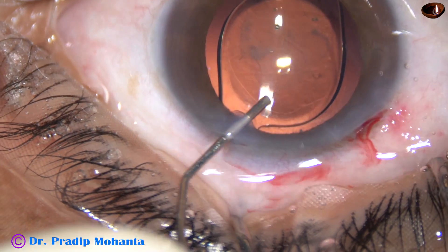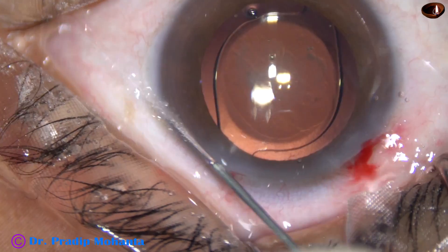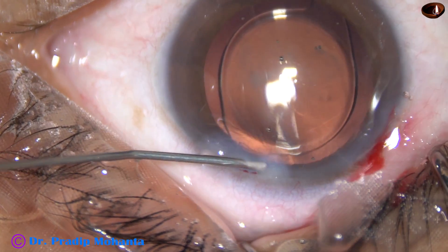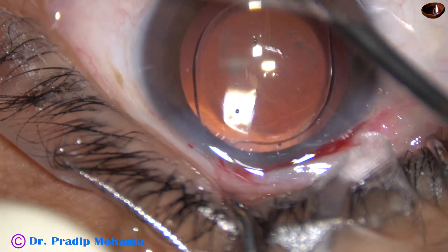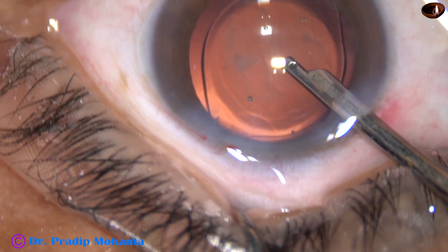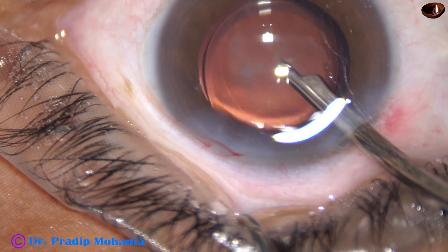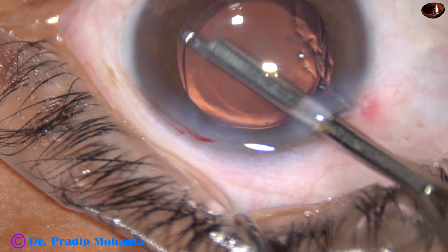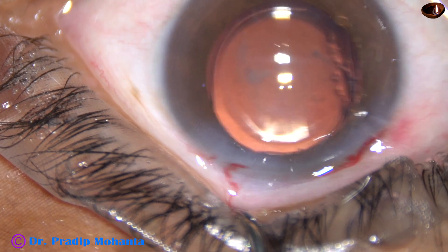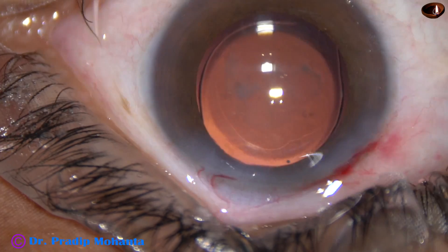Now the side port is to be closed. Corneal stroma on either side of the side port is hydrated, the lips of the side port become thick, and the opening closes and becomes watertight. Now this is the final lavage of the anterior chamber — a gentle stream of BSS is directed towards the corneal endothelium, and whatever visco sticks to the corneal endothelium comes out. The anterior chamber is formed very nicely. The integrity of the wounds is checked by a cotton-tipped applicator, the intraocular pressure is felt digitally, and then the case is concluded.